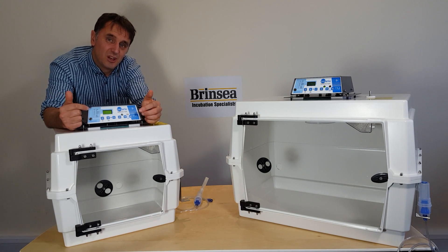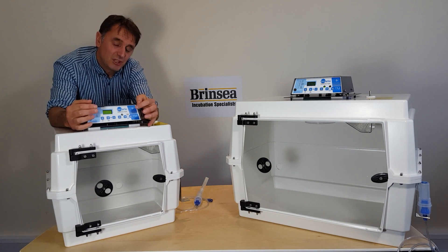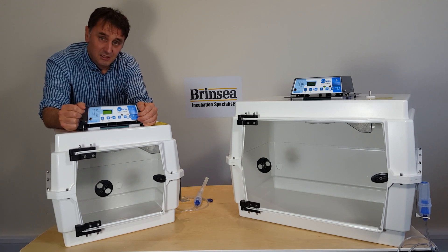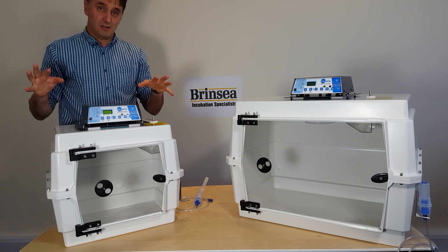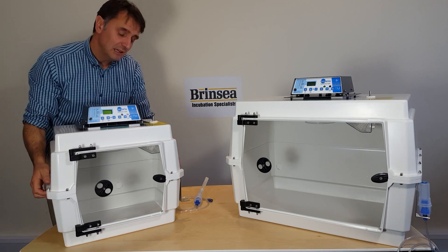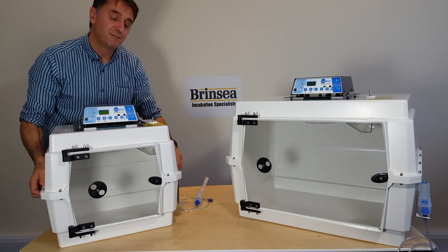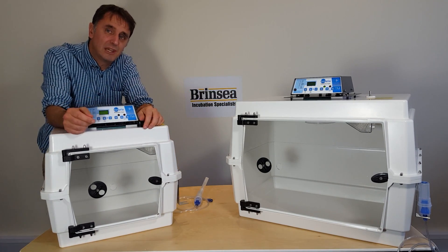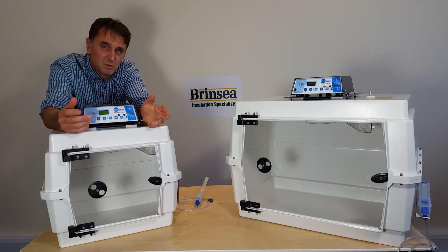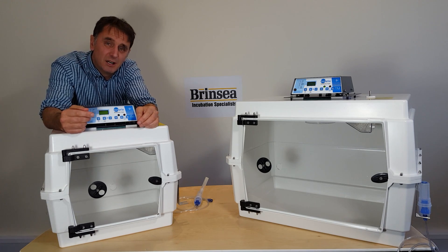Instructions on how to clean and maintain the machine come with the machine. These units are quite light — the T40 is only 7.2 kilos and the T50 is 9.2 kilos — meaning you can move it from one room to another, or even from one practice to another if required.